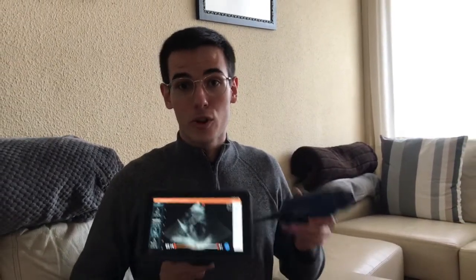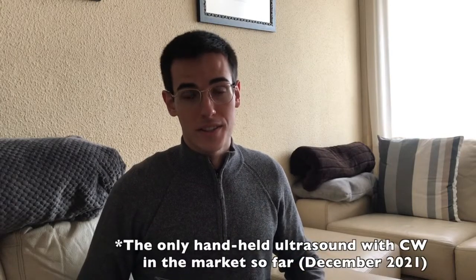Hello guys, this is Alex from Masters of Ultrasound and today we're going to review the Cosmos device. As you can see, it is a wired phased array scanner with an integrated tablet, and it has continuous Doppler as a unique characteristic.